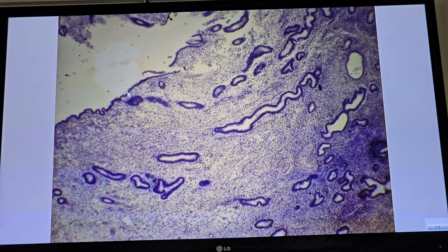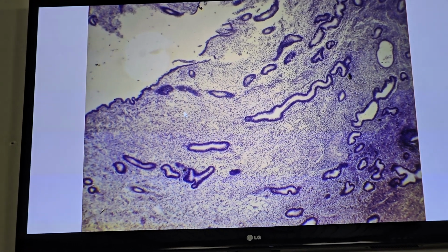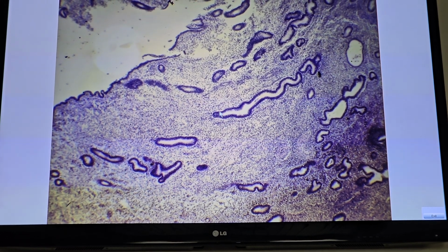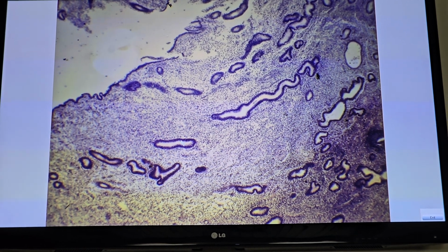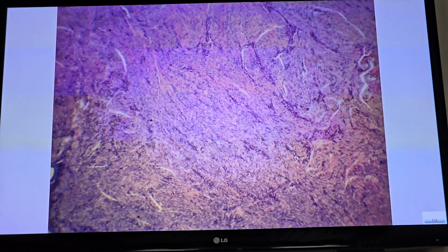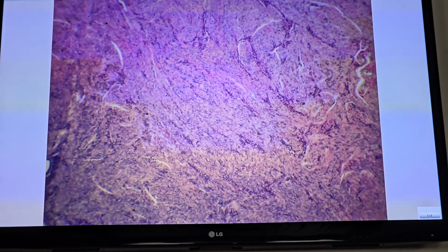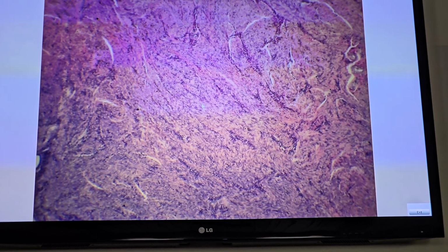Consisting of the surface epithelium, which is simple columnar epithelium with two types of cells. Beneath is lamina propria of connective tissue, within lamina propria we can see the uterine glands. Uterine glands. Second layer, which is the thickest layer, highly vascularized muscular layer called the myometrium. This is the myometrium. Third layer is not seen in this section called perimetrium, is an adventitial layer.